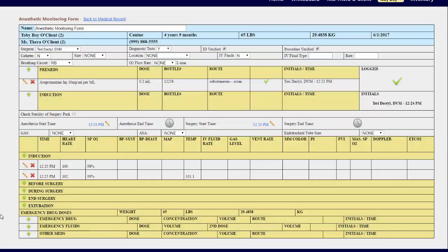Under the emergency drug doses section, these are like the pre-med and induction sections above and can be logged as well.